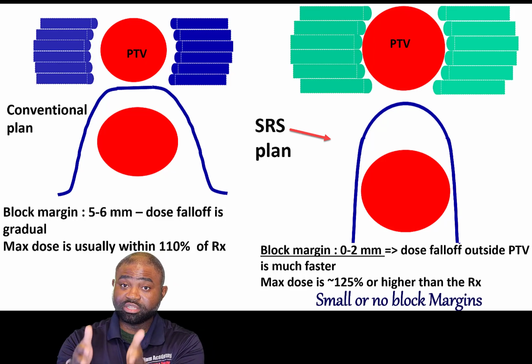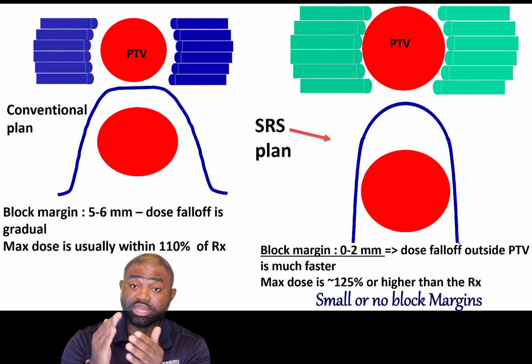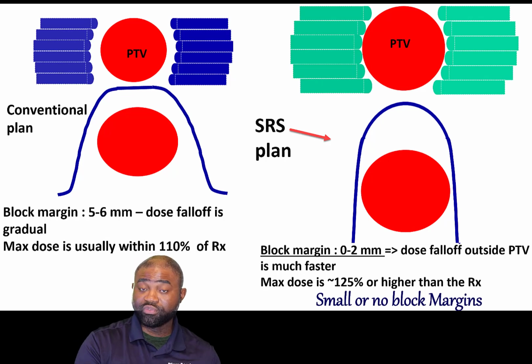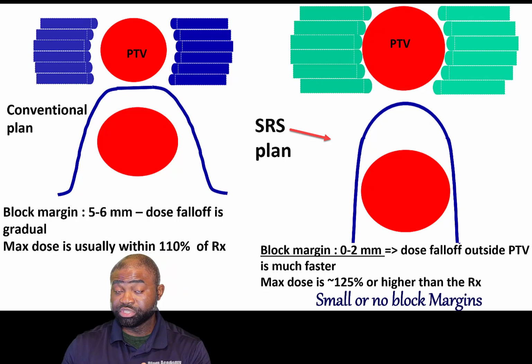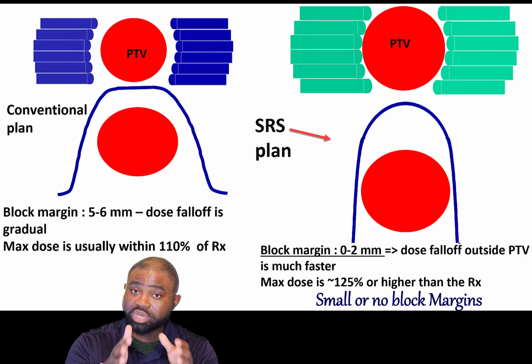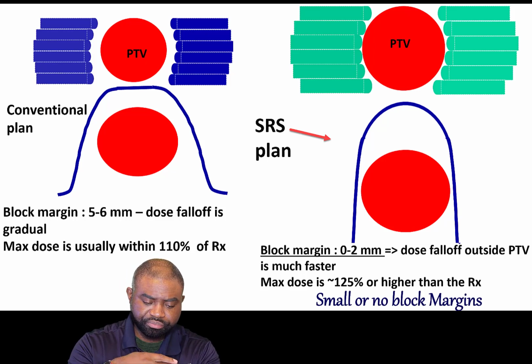But the fundamental premise in stereotactic procedures is the fact that we deliver a heterogeneous dose distribution within the target, not uniform but very heterogeneous, and this is actually encouraged because a higher dose is delivered to the core of the target that is hypothesized to have what we call hypoxic, highly resistant cells to radiation.